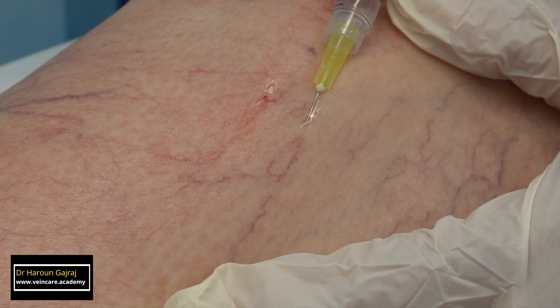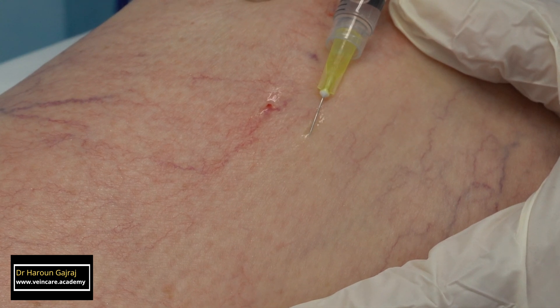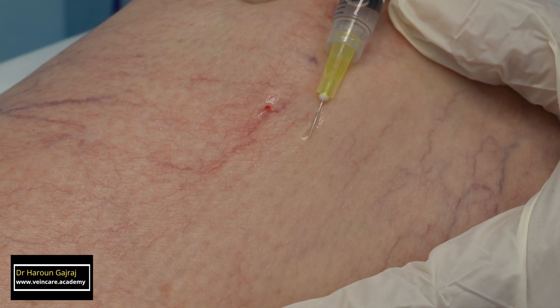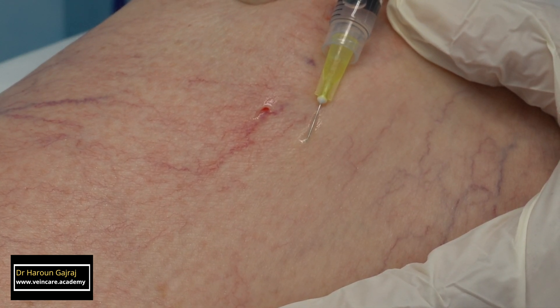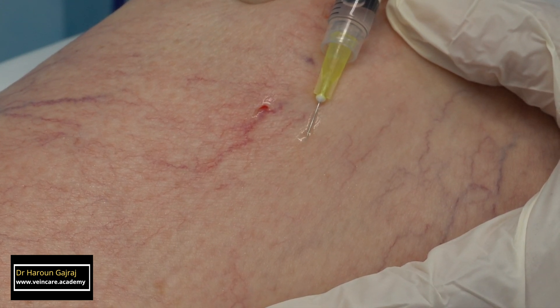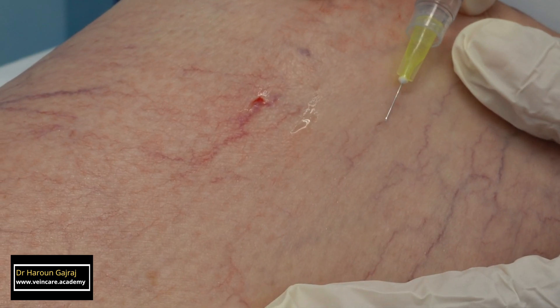The needle tip should be observed at all times. The injection must be stopped immediately if a bleb appears, which indicates extravasation, or if there is blanching of the skin — in contrast to blanching of the vessels — which indicates veno-arteriolar reflex venospasm, or injection directly into a small arteriole. In addition, injection must be stopped immediately if the patient experiences pain.